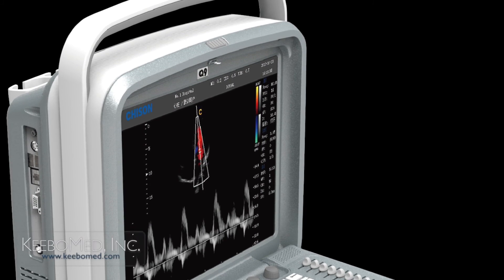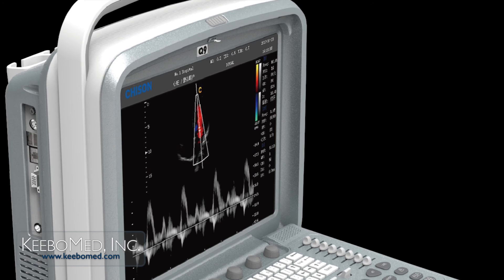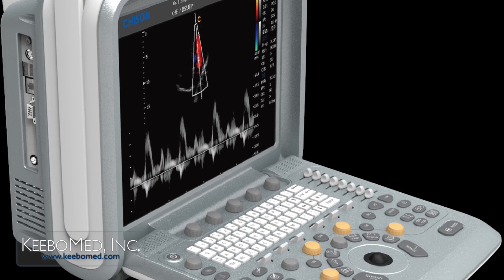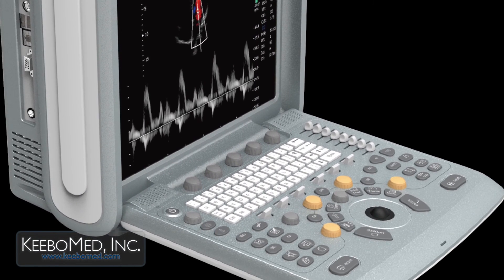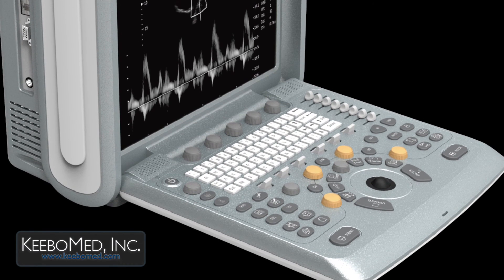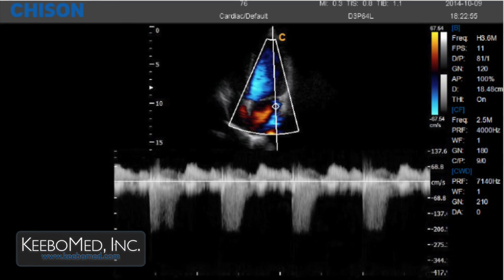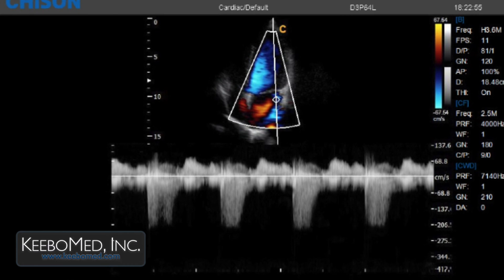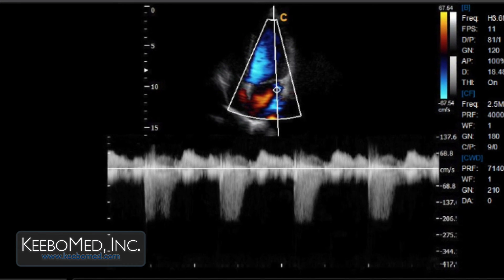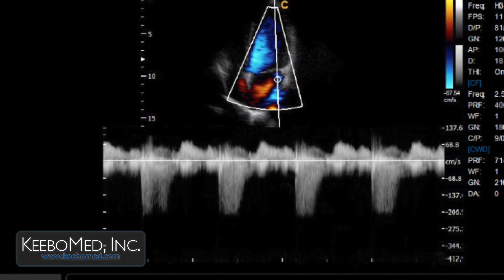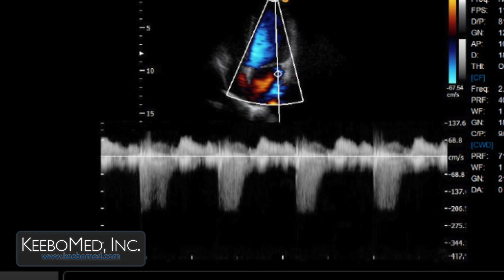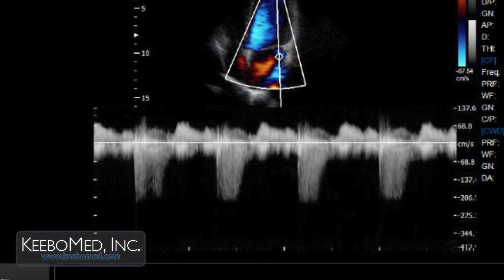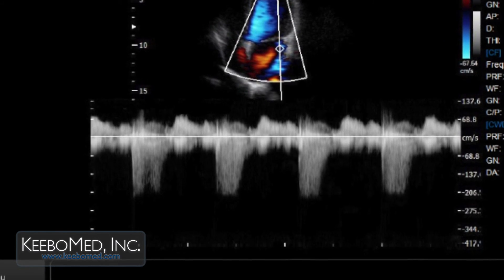The Chyston Q9 is a fully digital color Doppler ultrasound with some of the best functions and features available today. One of the most important functions of the Q9 is the continuous wave Doppler, which will detect blood flow with high velocity so that the most advanced cardiac examinations can be performed. This function is the main difference between the Q5 and the Q9.